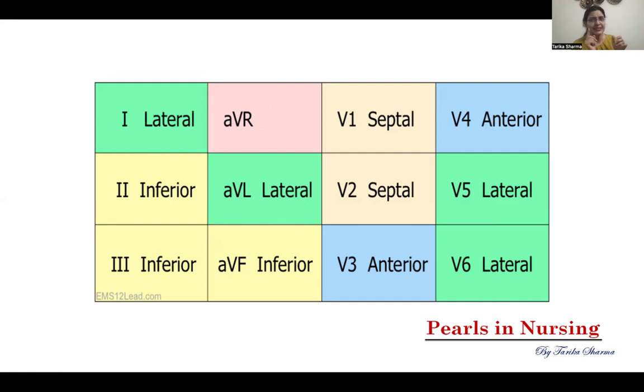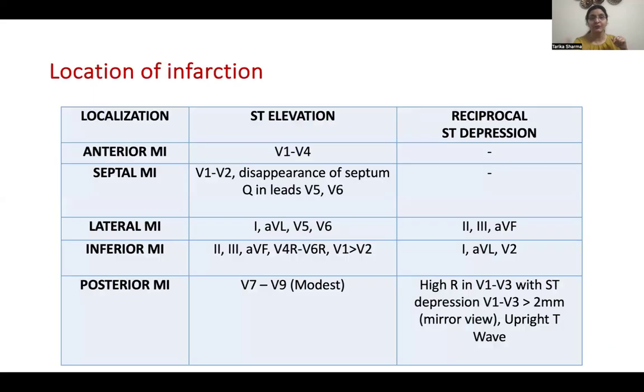हैं, राइट? यू विल टेल मी इन द कमेंट्स which portion of the heart does the AVR signifies. I have not told you, but you have to. This is your assignment. You have to find out, does AVR also denote some of the portion or something else, right? So we'll talk about the location of infarction.